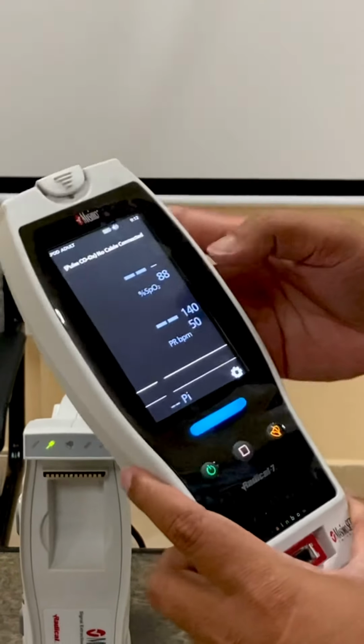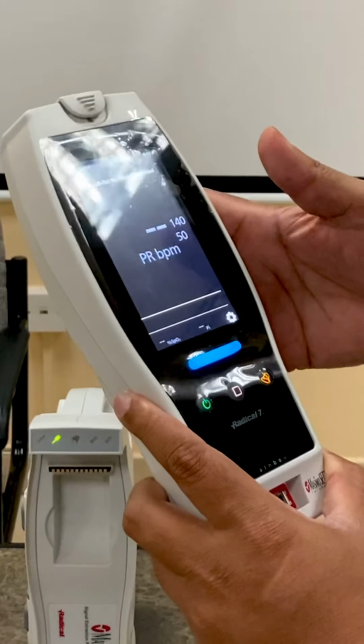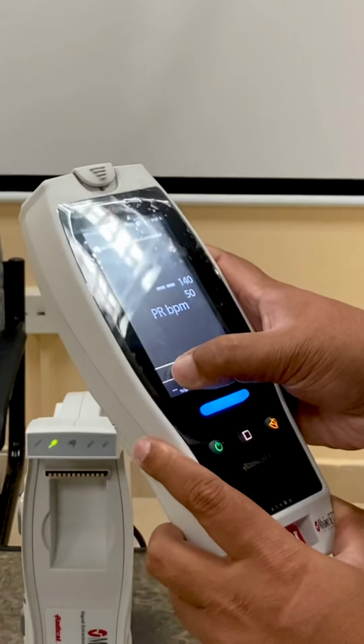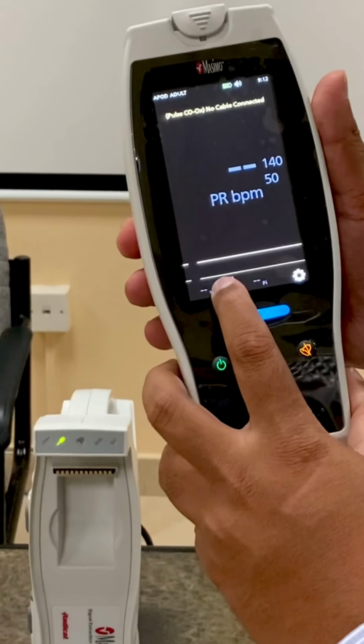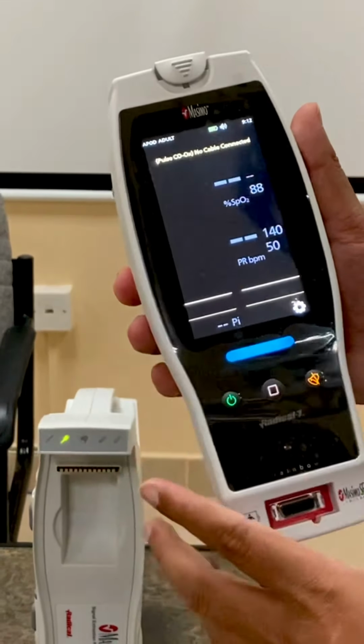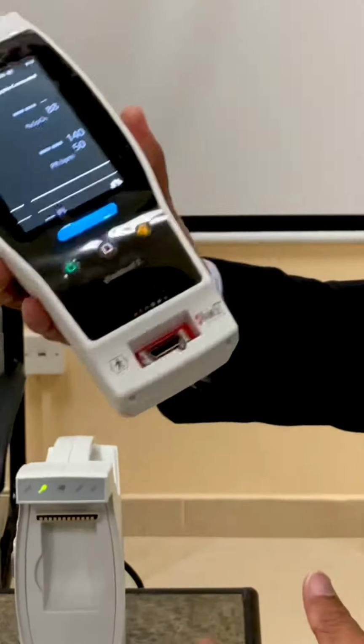And then if it's already in a bigger position, even if you don't need it, you can go down, and anytime you need it bigger, just press it there and it will be there. Yeah, so this is all about this device.